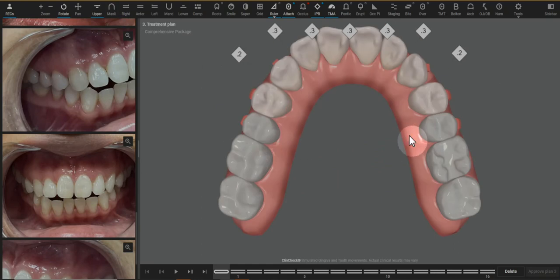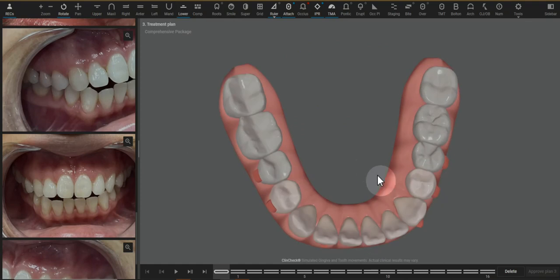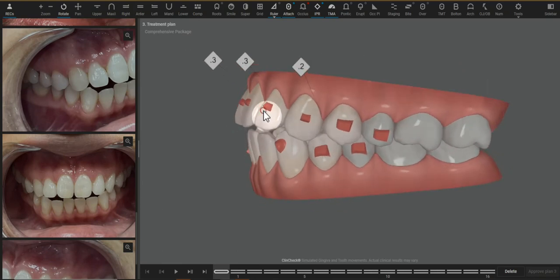She has a sufficiently wide arch through the molars, and increasing the width of the premolars is unlikely to reduce the amount of IPR needed here. Because the IPR isn't planned so much for needing to create more space — it's meant to help reduce the flare.